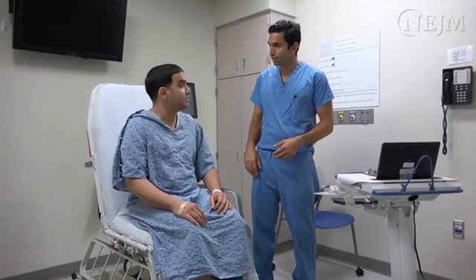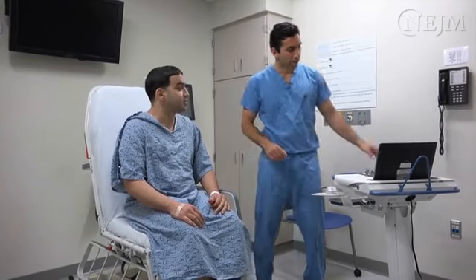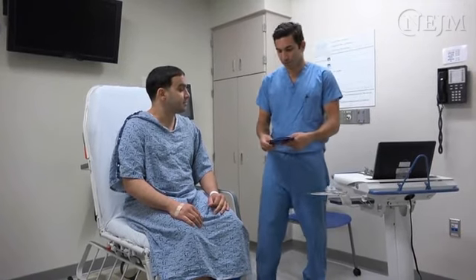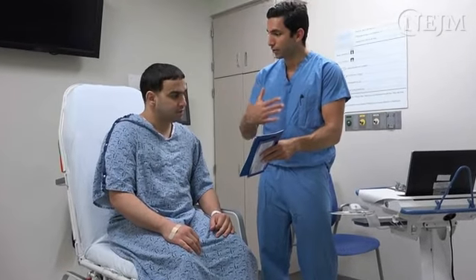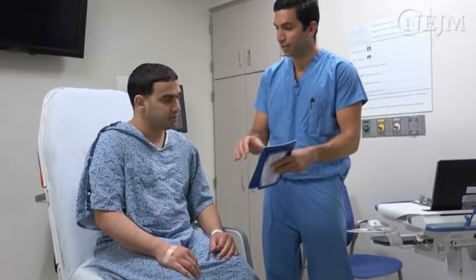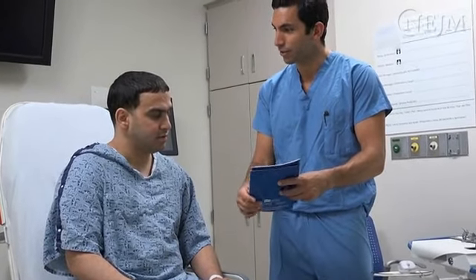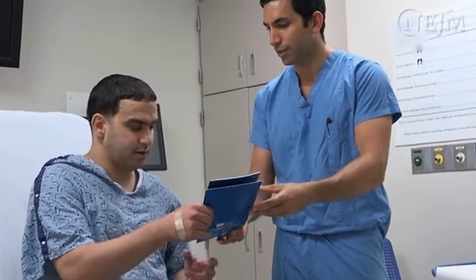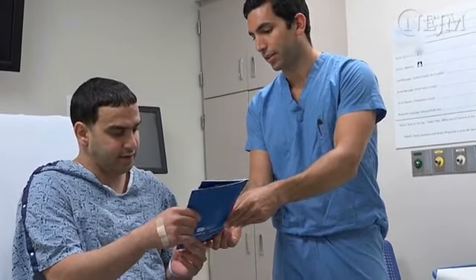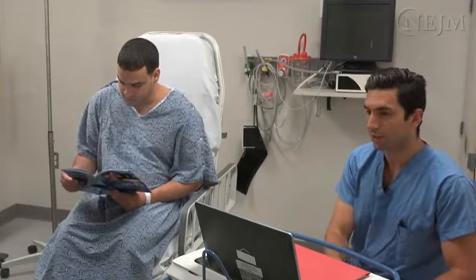Explain to the patient that a delayed reaction may occur after transfusion, particularly in outpatients, and that it is necessary to contact a clinician and consider returning to the hospital if such a reaction occurs. Delayed symptoms, including fever, rash, difficulty breathing, and change in urine color, may occur days or weeks after the transfusion. Provide this information to the patient both orally and in written materials. Finally, document the procedure in the patient's medical record.